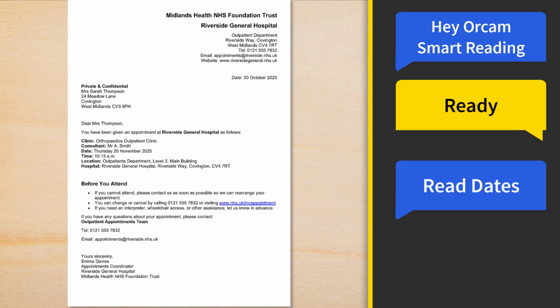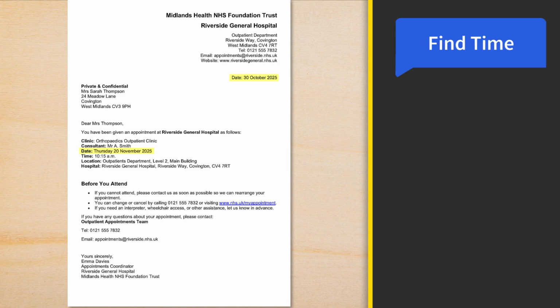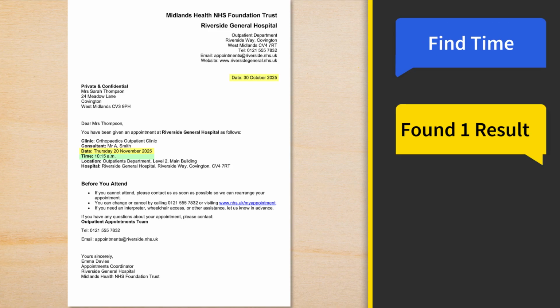Ready. Read dates. Found 2 dates. First result. Date, the 30th of October 2025. Second result. Date, Thursday, the 20th of November 2025. Find time. Found 1 result of time. The 20th of November 2025 time. 10:15 a.m. Location.